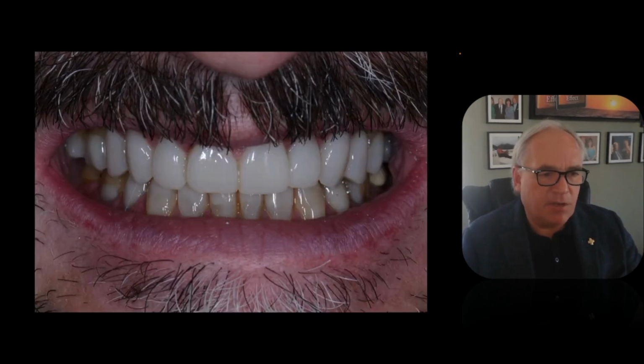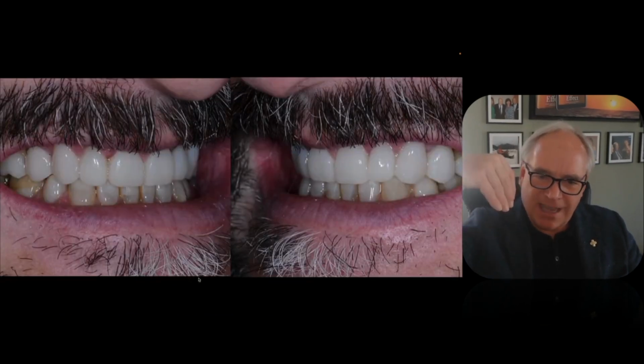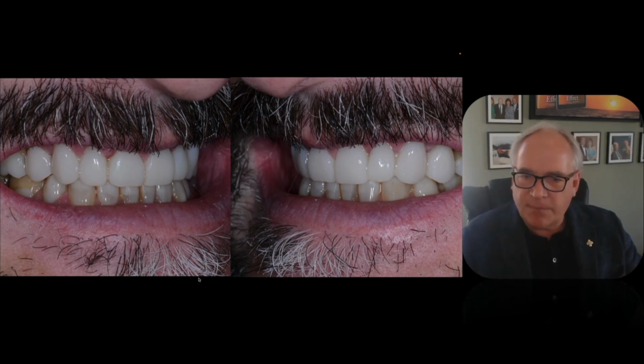This is the printed provisional in place. We're pretty happy with it. The one thing that I did notice was it was slightly to the lingual, so I want to increase his overjet a little bit more. That will shallow his guidance. I'll explain that in a little bit more detail later.